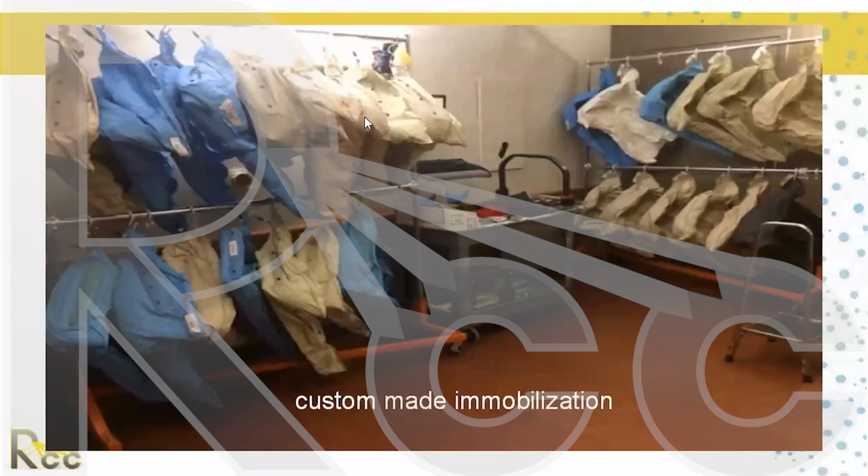And this immobilization could be for any part of the body. You could immobilize the legs, the feet, the chest, the arms, any part of the body. Immobilize it, image it, and then plan it in that position. And these are unique for each patient. Each patient owns one of these. This is for all the different patients that we treat.